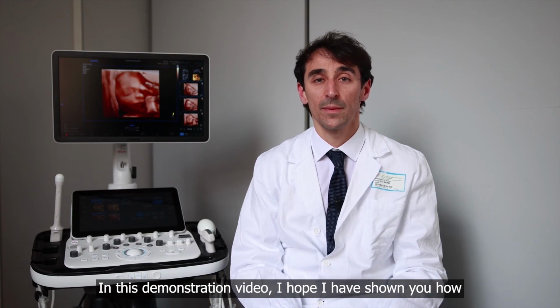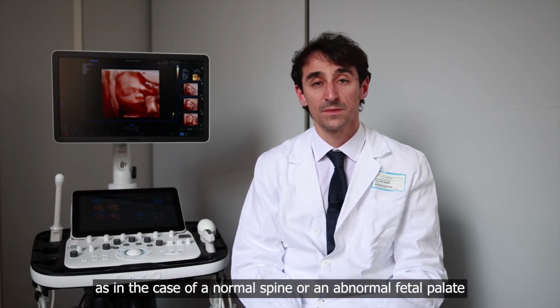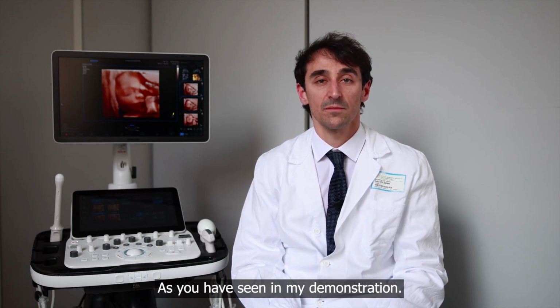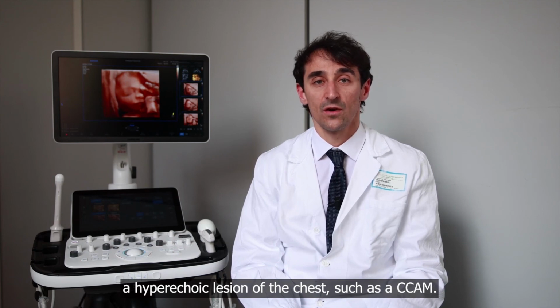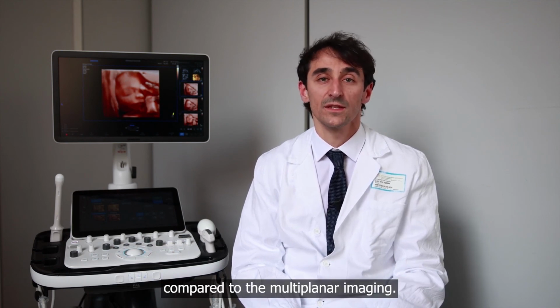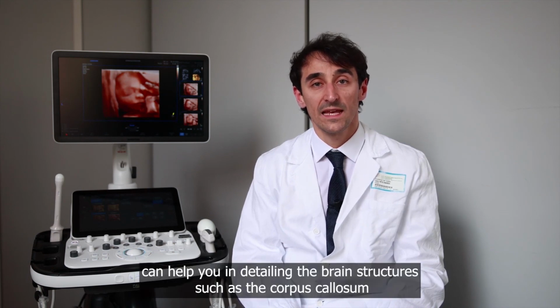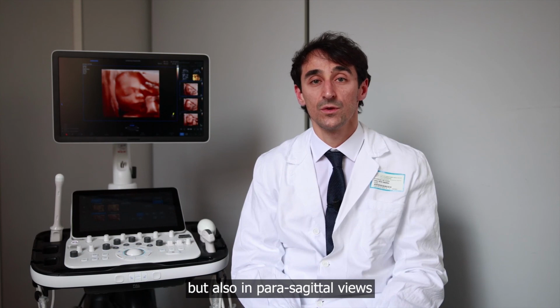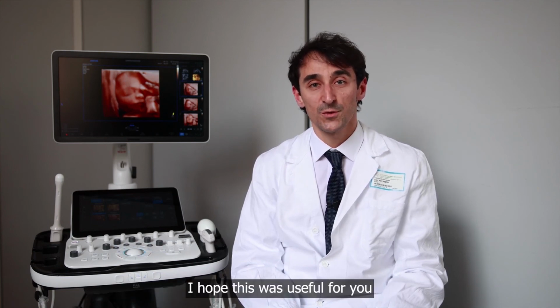In this demonstration video, I hope I have shown you how CrystalVue can help you in detailing bony structures, as is the case of a normal spine or an abnormal fetal palate in the event of a cleft of the secondary palate, as you have seen in my demonstration. And I also have shown you how to image a hyperechoic lesion of the chest, such as a CPAM. You've seen how the three-dimensional render views are vivid compared to the multiplanar imaging. And finally, you've seen, in the case of normal brain, how CrystalVue together with RealisticVue can help you in detailing the brain structures, such as the corpus callosum and the cerebellar vermis on the mid-sagittal view, but also in parasagittal views, the wall of the lateral ventricles as well as the choroid plexuses. I hope this was useful for you, and thank you for your attention.